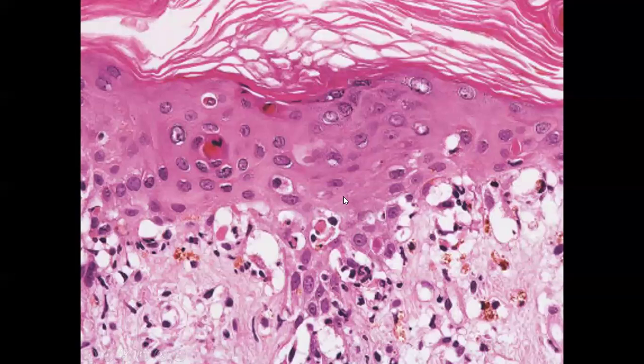So there is no lymphohistiocytic band-like infiltrate, which we see in lichen planus. So that is not a feature. It is just the interface change.